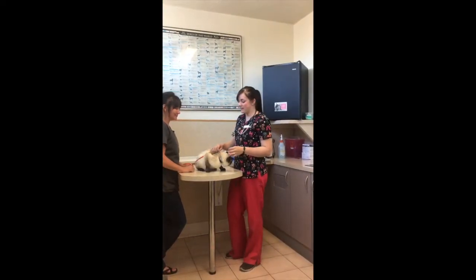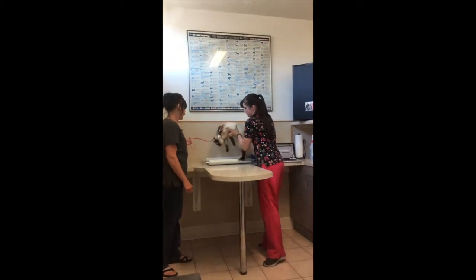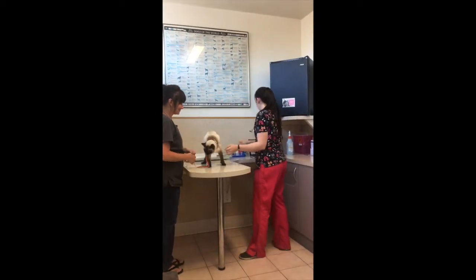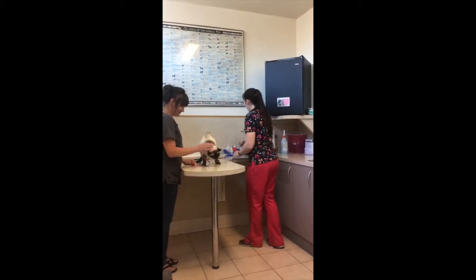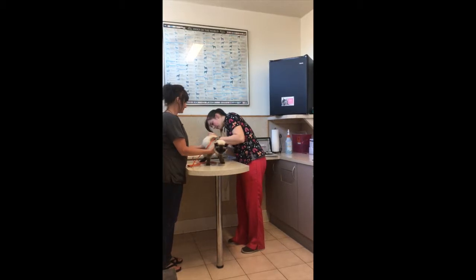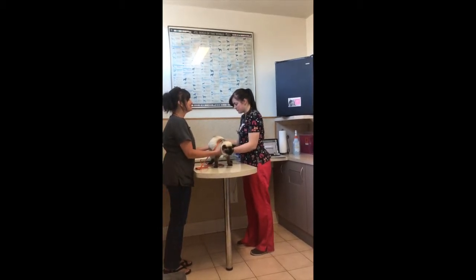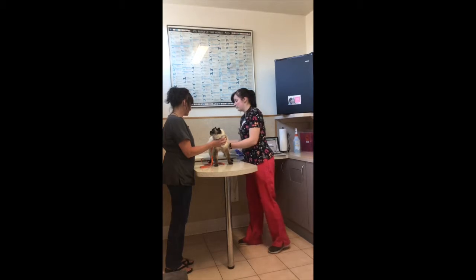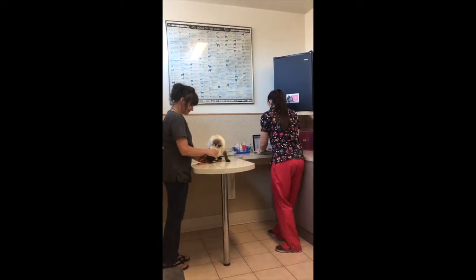Okay, I'm going to be doing an exam on Pookie Bear here. So first off, we're going to get a weight on Pookie. All right, 7.74, so I'm going to enter that into her SOAP exam. Next, we're going to get a temperature on her. All right, her temperature's 101.1, that's normal. I'll put that into the SOAP exam.